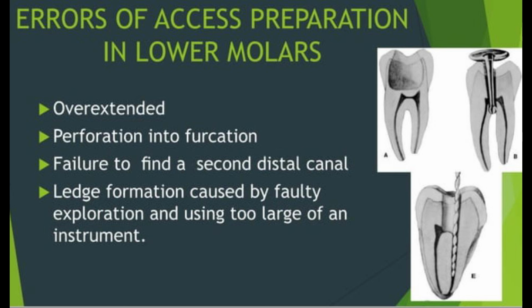The GG drills are non-end cutting and self-centering, so care must be taken to avoid strip perforation or overcutting at the furcation area. The pulp chambers should not be completely de-roofed. Some of the roof is preserved all around the periphery of the tooth, which is also known as the soffit, to avoid damage to the lateral walls.